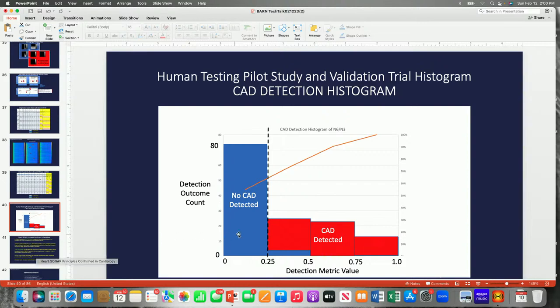We're starting down this road of basically clinical trials. Testing a medical device is not the same as testing a pharmaceutical. FDA rules for medical devices aren't as severe as pharmaceuticals. In fact, we already have FDA approval for human testing with this device. They liked what we were doing. It's a type 1 device. It doesn't risk anybody's life when you put it on somebody and take data. So the FDA said, go ahead, you're all set. We'll record that you talked to us on such and such a date, and so we're good to go there.